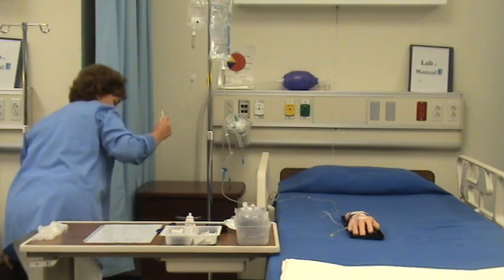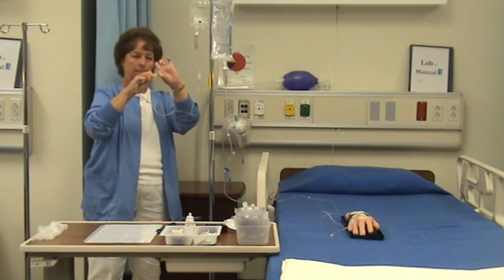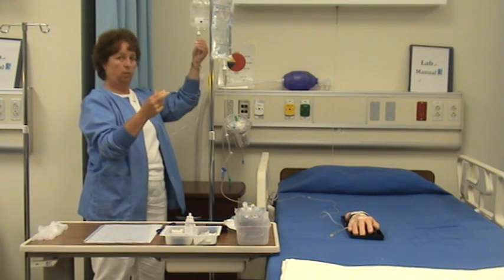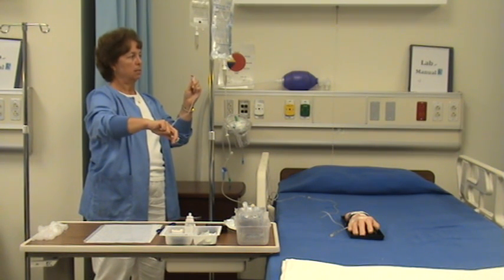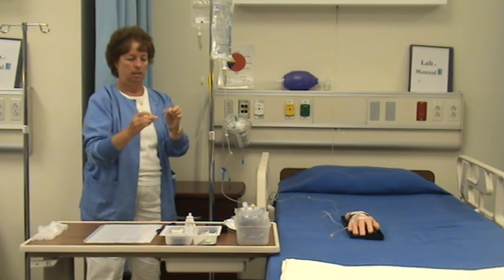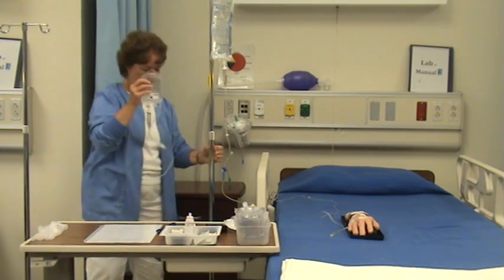So I need something to prime it into. I've got the trash here. Take my cover off the alligator clamp, hold it in my hand, and squeeze the drip chamber so I don't get any air in the tubing, and slowly prime the tubing. Again, you don't want to waste any of this because it's medication. Just to the end, okay. Recap.